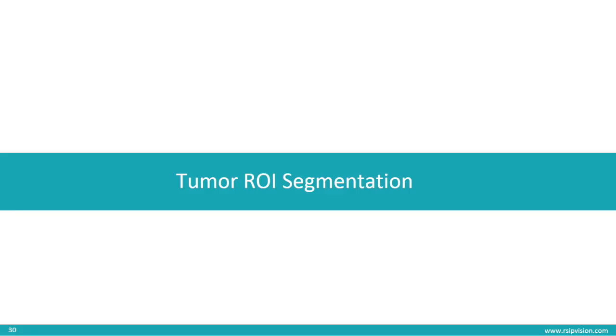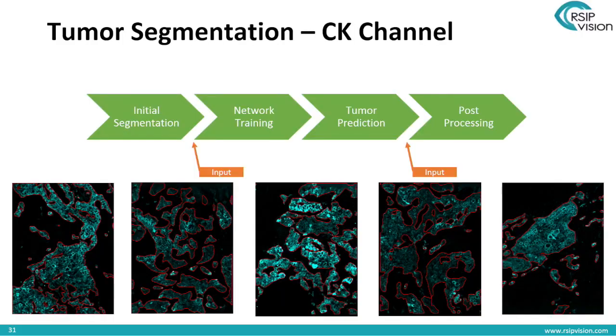This is tumor region of interest segmentation. So now we're looking for regions of the image which are suspected tumor regions or some other region of interest. So it's a very different task in the sense that you're not looking for individual blobs in an image. From a computer vision guy's perspective, you need to zoom out, to squint, and to look at the areas, but you still want it to be accurate. You still want to get holes in this region correctly.